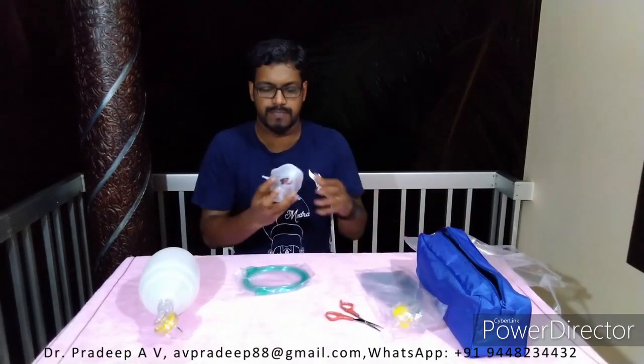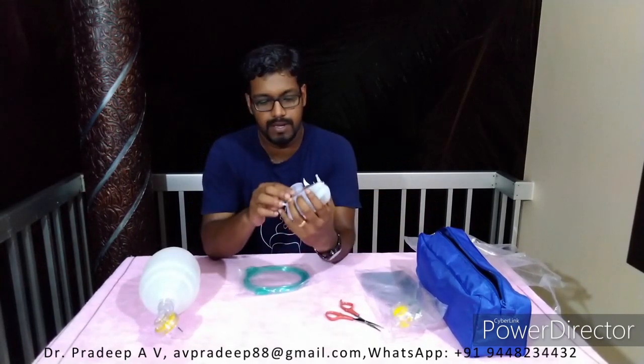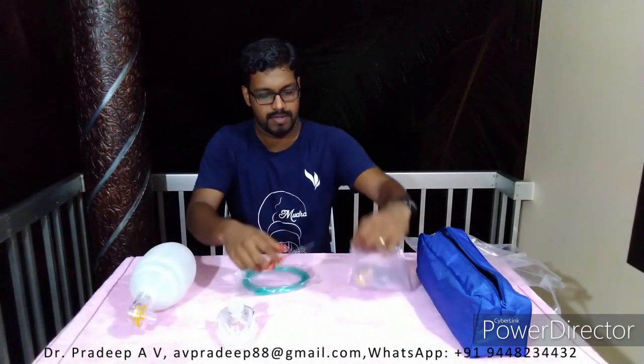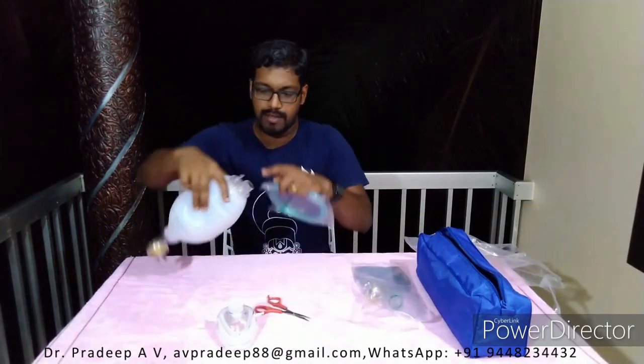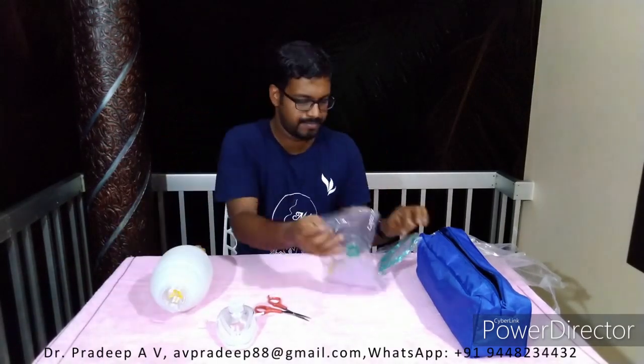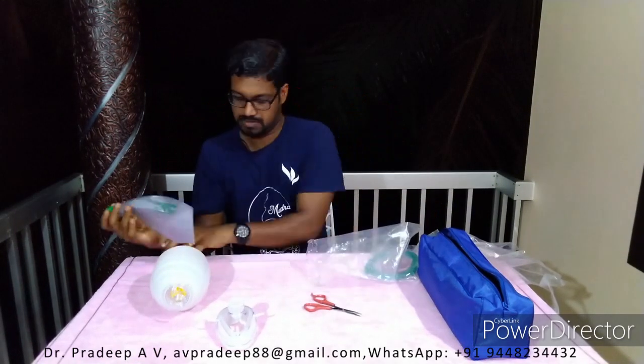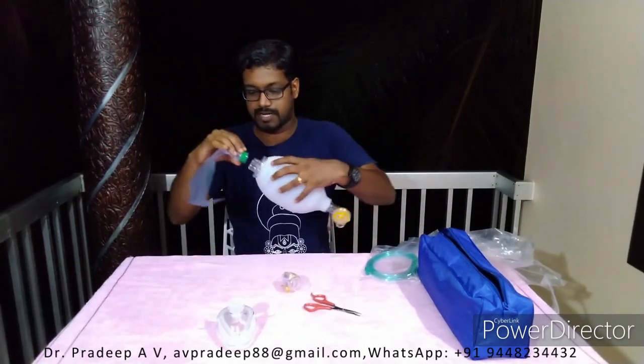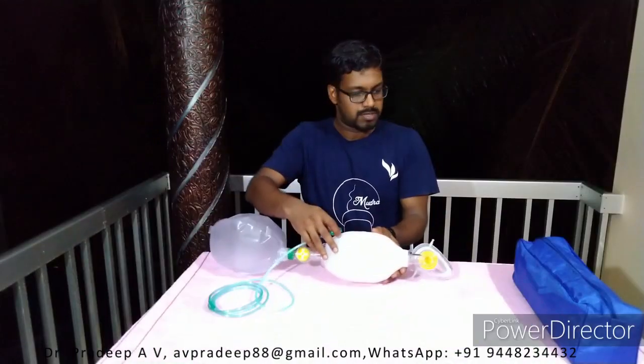This is the face mask. So you have to keep it here like this. And the bag will be connected like this. This is to be connected from here to an oxygen cylinder. This is the oxygen reserve. It is supposed to be connected here, and this is the valve. Let us connect it and see.